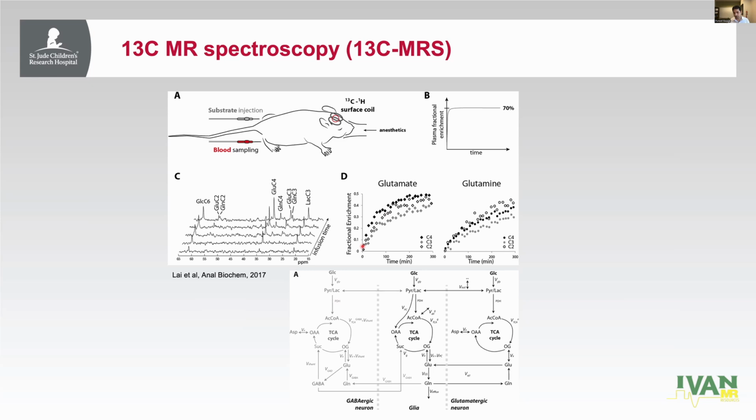But the only problem is 13C is, as we all know, a very insensitive sort of nuclei. And all our rates depend on the initial turnover, which is very, very noisy. So it lacks that kick for translation into the clinic, so to speak.